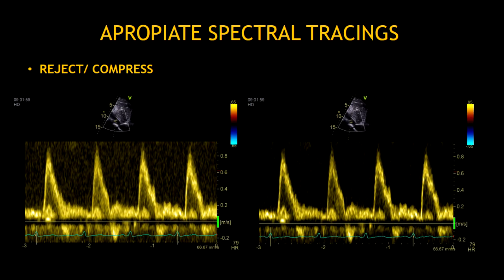In this image, I'm showing you how I use the reject and compress buttons to improve the quality of the pulse wave Doppler signal. By using this tool, you can see how the image on the right appears to be more clean, sharper, and without noise.